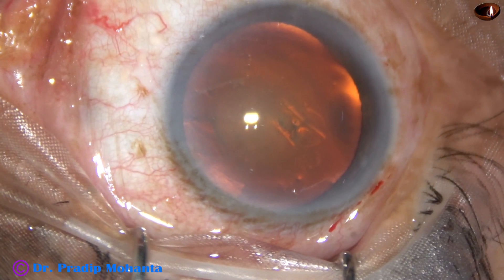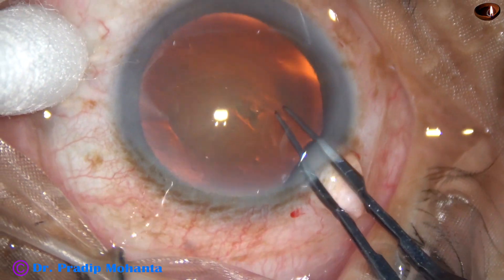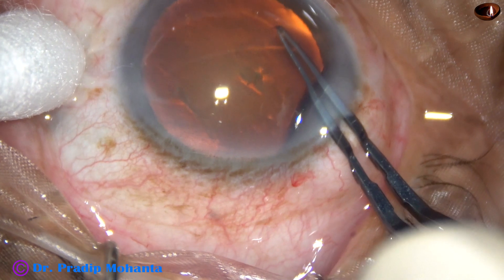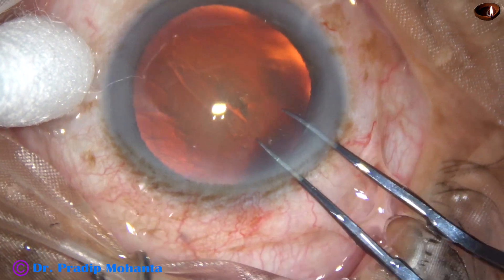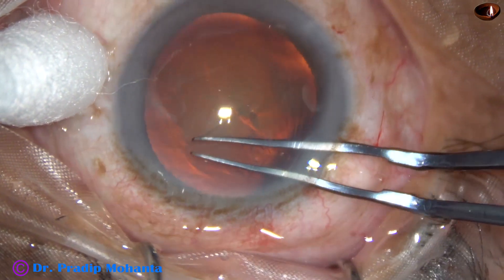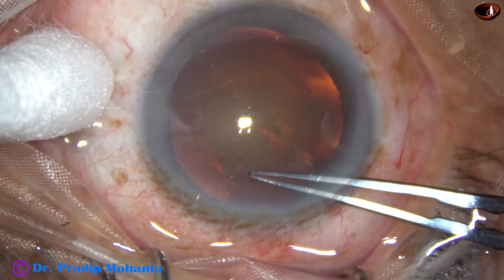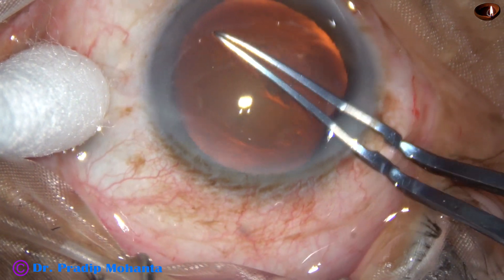Capsulorhexis is a very important step of cataract surgery nowadays. Whether you do small incision cataract surgery or phacoemulsification, whatever you do, capsulorhexis is a very important step. In this video, I am going to show capsulorhexis with utrata forceps.